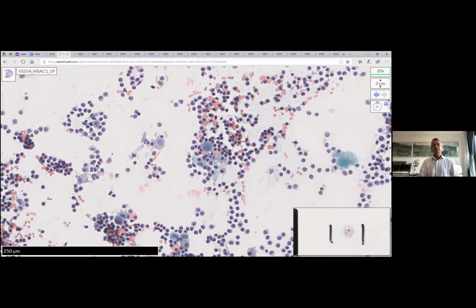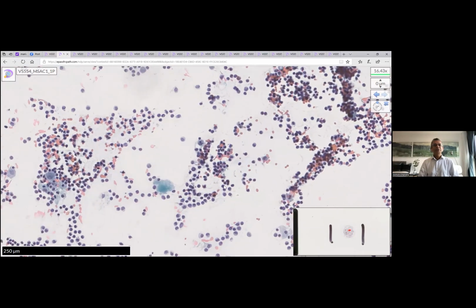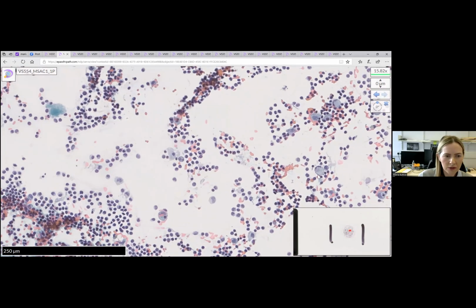Good idea to open all the presentations in one go, Maria, rather than pausing to open them one by one. Very good. So this is the PAP cytospin on this pleural effusion. That's right. And I'm just showing you a few representative fields which are the same in general.